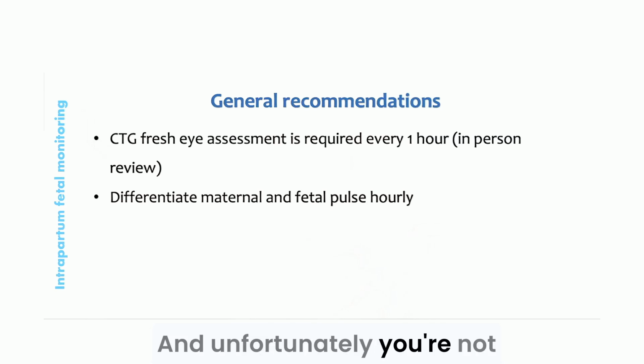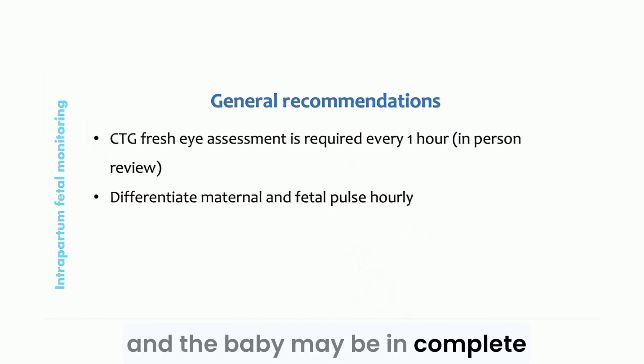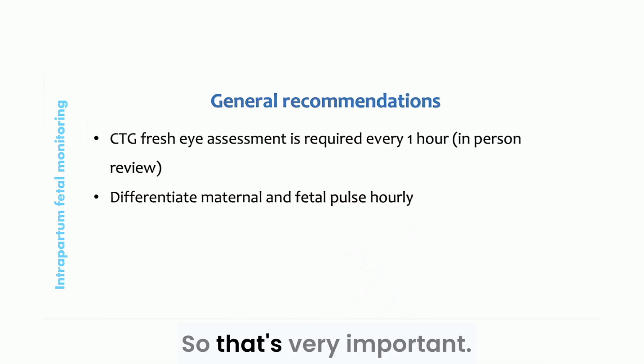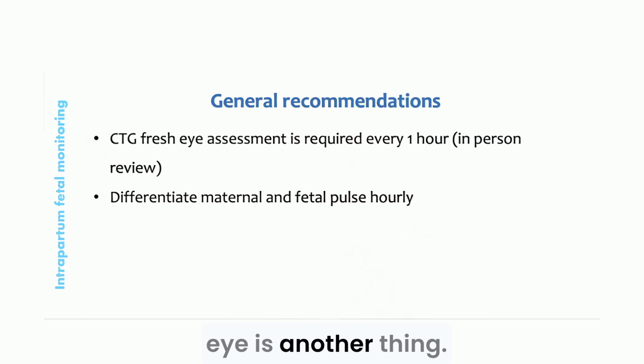And unfortunately, you're not monitoring any sort of a heart rate. And the baby may be in complete distress or maybe even an intrauterine fetal death without really knowing. So that's very important. And the importance of a fresh eye is another thing.